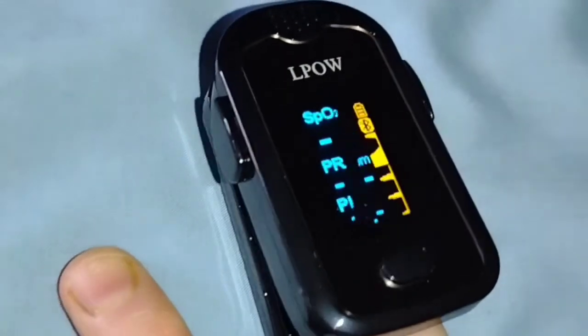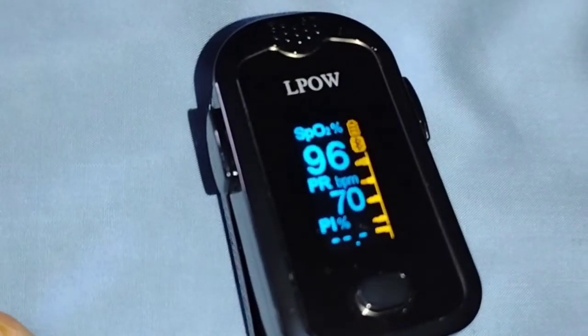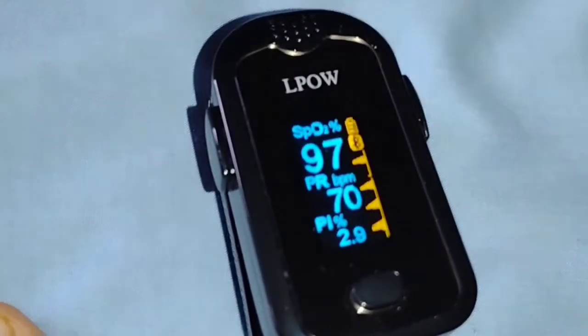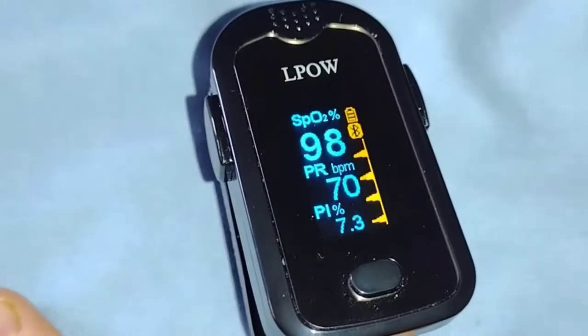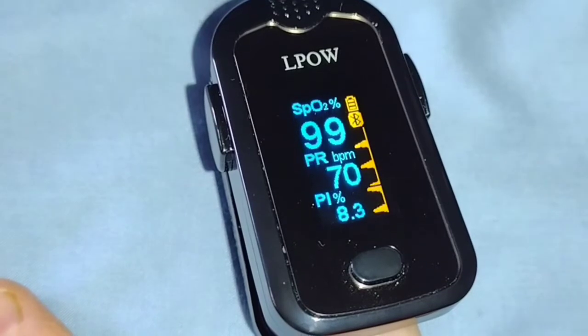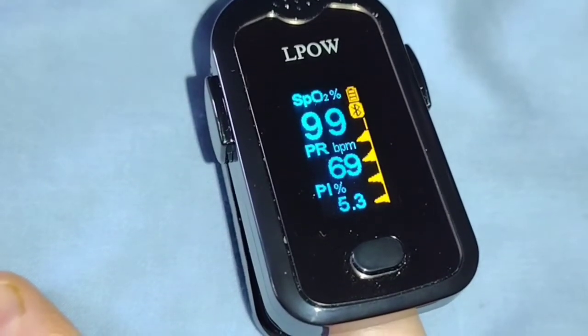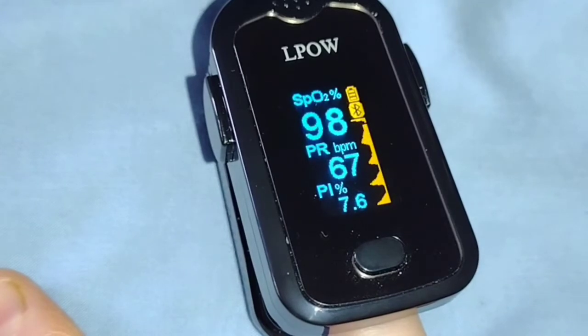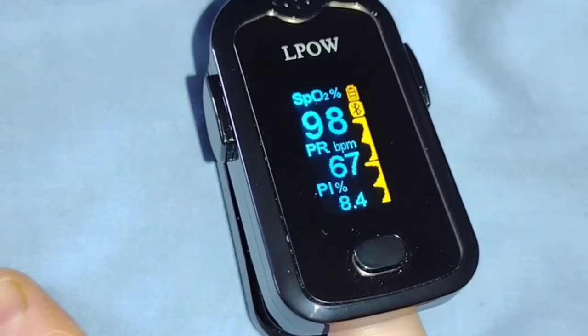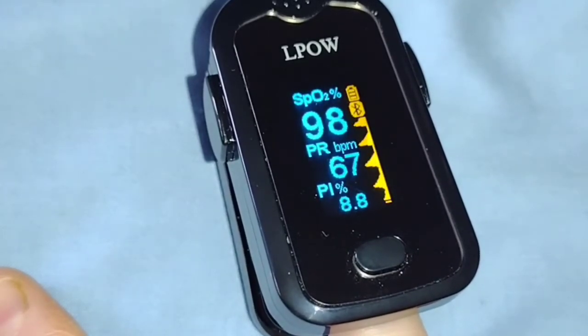The oximeter works extremely fast — it only takes eight seconds and you have your measurements immediately. As you can see, the numbers are displayed on an OLED display. They are very easy to read and the numbers are big, so no matter if you have a vision problem or not, it will be very easy to read the numbers.